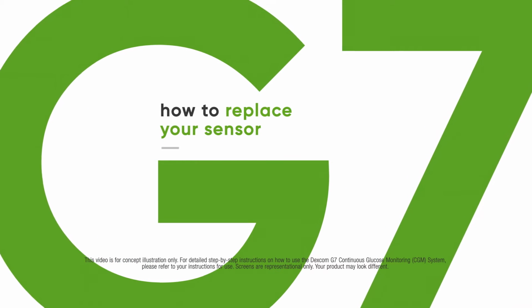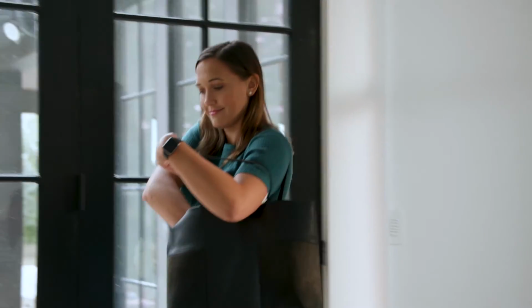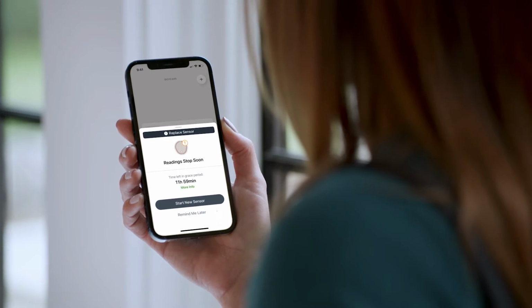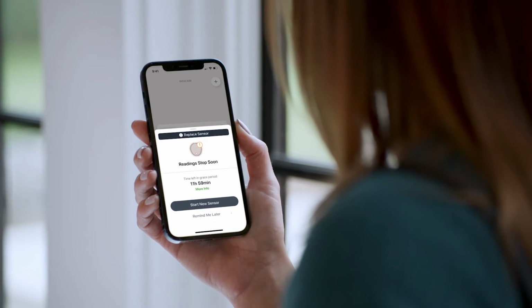Your sensor has a 12-hour grace period at the end of the session. You'll get alerts letting you know your sensor session or grace period will end. The grace period gives you more time to replace your sensor, so you can do it when it's convenient for you. You can either end your sensor early or wait until it automatically ends.